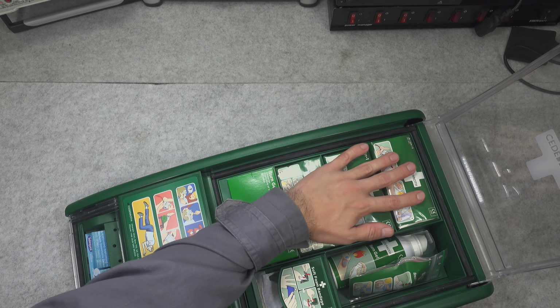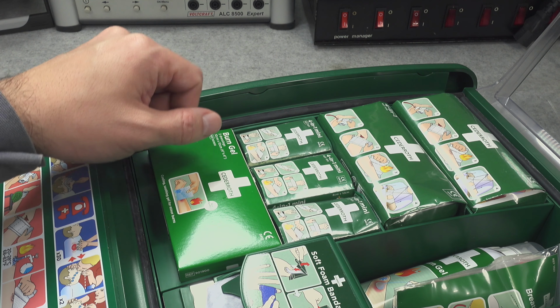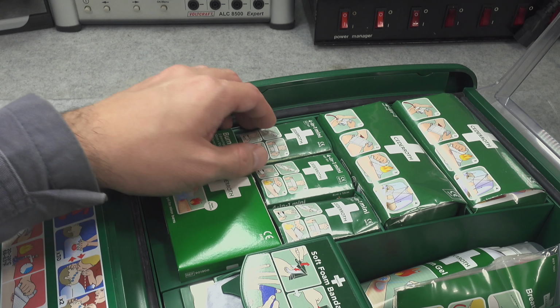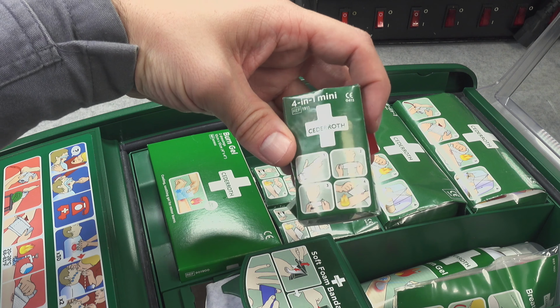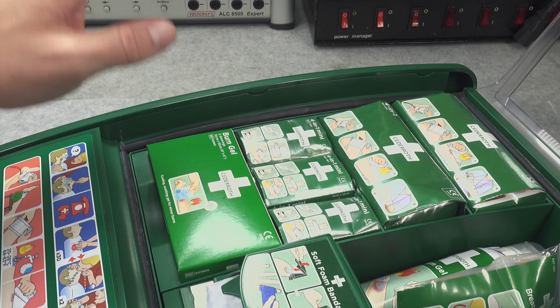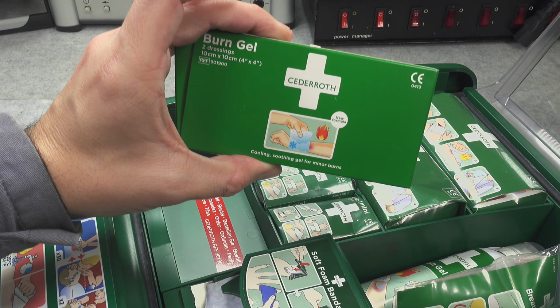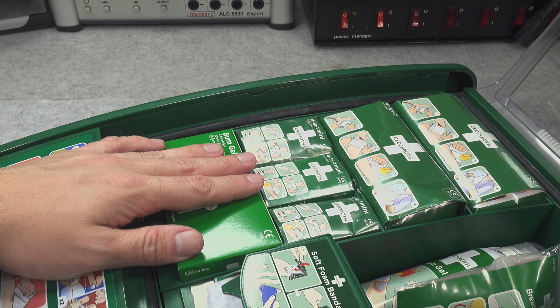This section is exactly the same. We've got two large universal dressings. I believe we opened one of those in the previous video. If we didn't, then when they expire, I will make a video and we will be playing around. Here we've got three small dressings, exactly the same as on the old unit, so nothing changed here. We've got our burn gel, absolutely beautiful, also exactly the same.